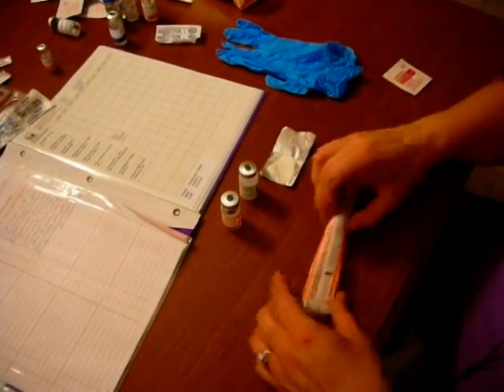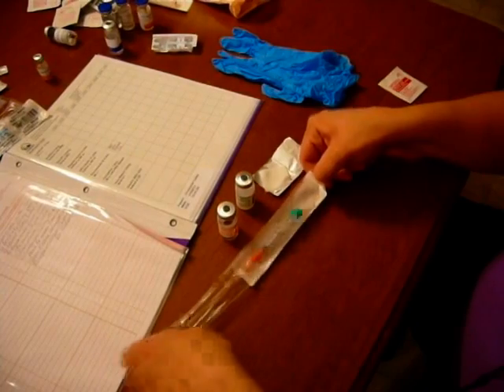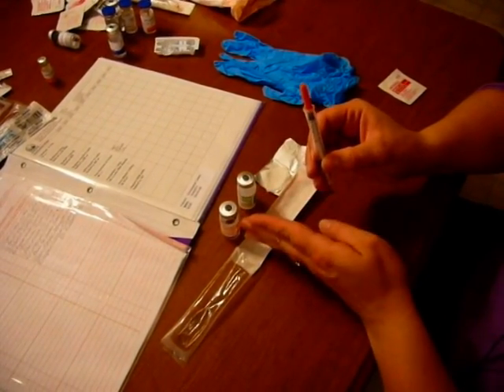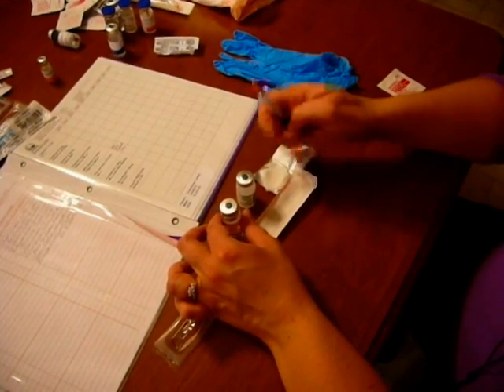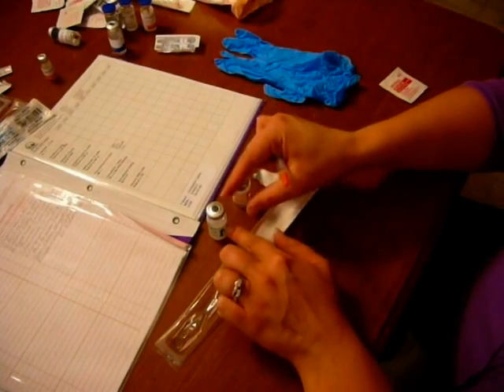If I touch the top, I would just re-alcohol the top to make sure it was clean. Next, I'm going to open my insulin syringe. I have to put air in and draw up in the same order. I'm going to talk about putting air in the long, air in the short, drawing up the short, and drawing up the long.